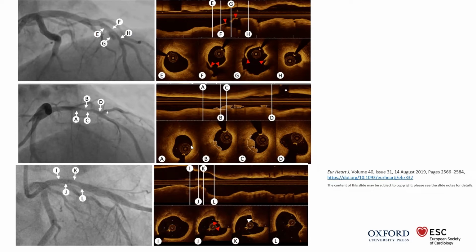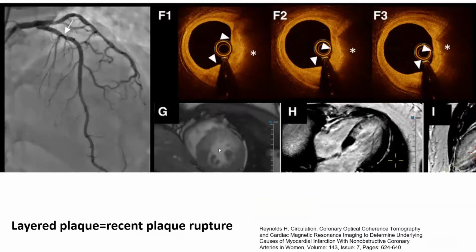This is here plaque erosion. Again, uninterrupted cap, relatively thick cap, uninterrupted, all of a sudden you see thrombus. You might think the cap is interrupted, but it's really shadowing from a red thrombus. So it's sometimes hard to tell for sure whether it is plaque rupture or not, but it's really very irregular. There is really no disruption. It's really very smooth. That area, that lumen goes very smoothly into the thrombus. So it's really hard to say there is cap rupture in this patient.